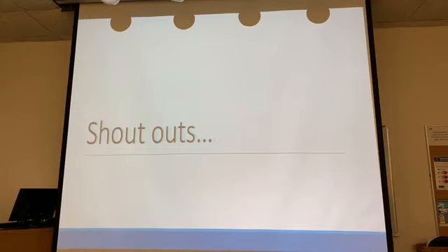So the question was, can we get the nasal cannula capnographs? That's something that Greg LeMay and I have actually been looking at, and I like it more and more as long as they're used responsibly. I think we had it many years ago, Don Elder was telling me about it, but the problem was people were just throwing them on everybody. Oh, you need the little nasal cannula oxygen, all right, let's put the capnograph cannula on them, when you don't necessarily need it on everybody. But you're right, the cost has significantly dropped to the point where there's not much difference between what we have now and having one of those. So I think that's something that we will definitely be entertaining.